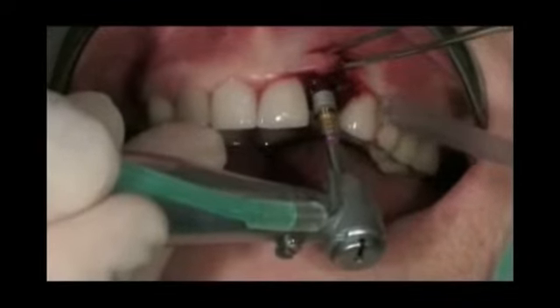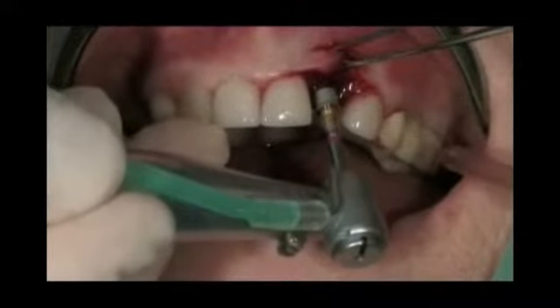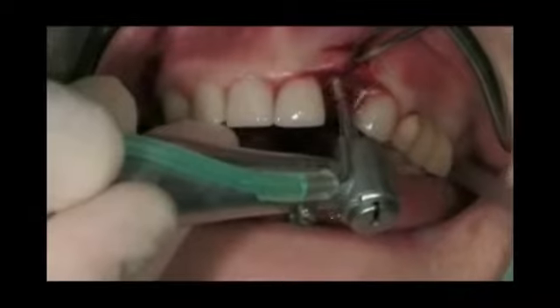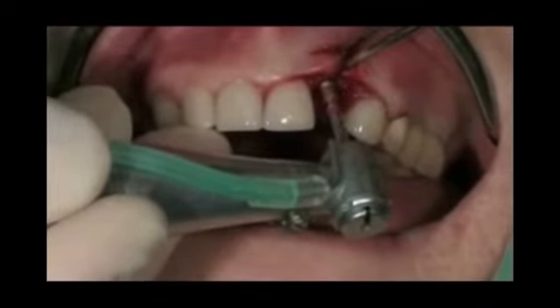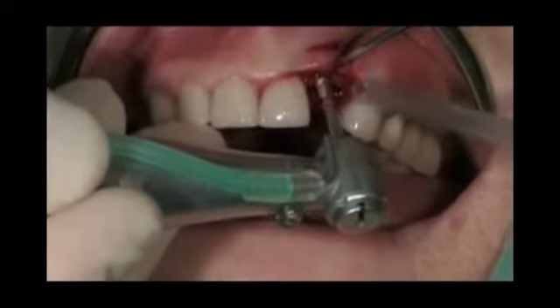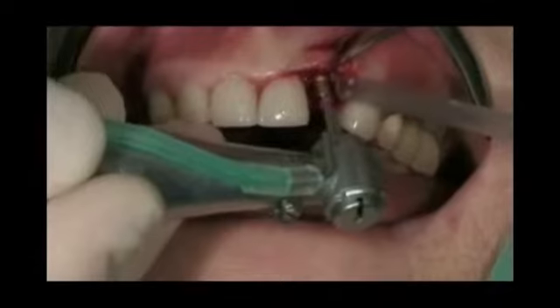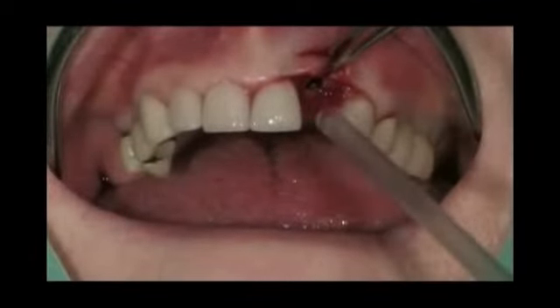The implant placement tool was removed from the internal interface of the implant, and an Osstell Smartpeg designed for the Certain internal connection was placed. An implant stability quotient, or ISQ, reading of 76 was obtained, which indicated a high level of initial implant stability. Since the patient requested an immediate fixed restoration and the implant achieved the acceptable torque and ISQ values, the decision was made to fabricate an immediate provisional restoration.